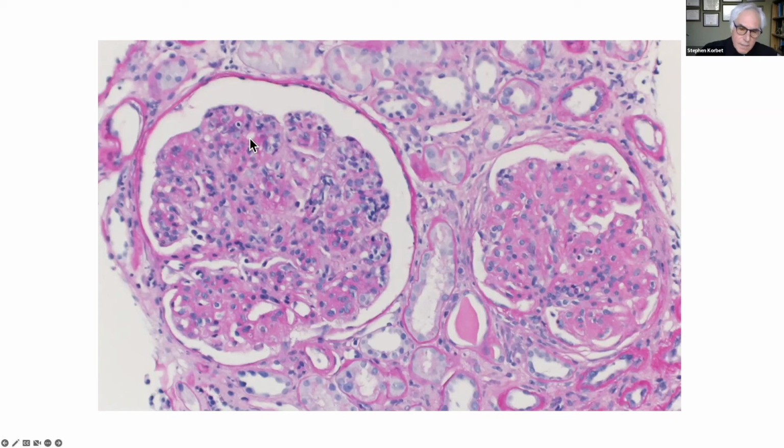A lot of that, I think, is mesangial interposition, right? All around it. Yes. That's a pretty advanced glomerulus compared to the first one that we saw. There are very few loops open and it's very cellular. It's really pretty remarkable. And on the glomerulus on the right, you get a better sense of just how small those lumens are. There aren't many lumens, which gets to Mario's question about the creatinine. On the one on the right, you also have adhesion at 9 o'clock, a segmental scar forming.